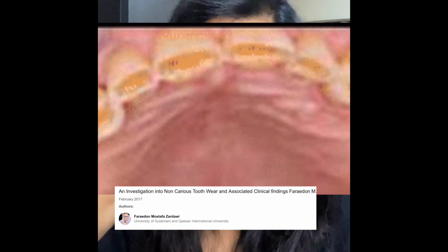So the triangular shape access opening is ideal, but not for all teeth, because as the patient gets older, the tooth ages and the root canal cross section turns oval. So in older patients, you can skip the triangular access and do an oval shape access opening. And also, as the teeth attrit in older patients, you can do an incisal access opening. That means when you can see a red dot on the incisal edge, you can clearly go and start your access near that red dot on the attrited tooth, and you can enlarge it, make it into an oval cavity so that your rotary files fit.